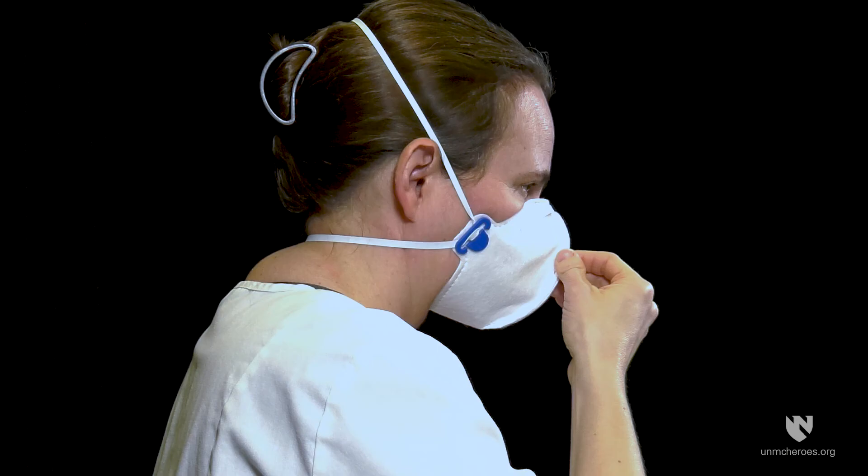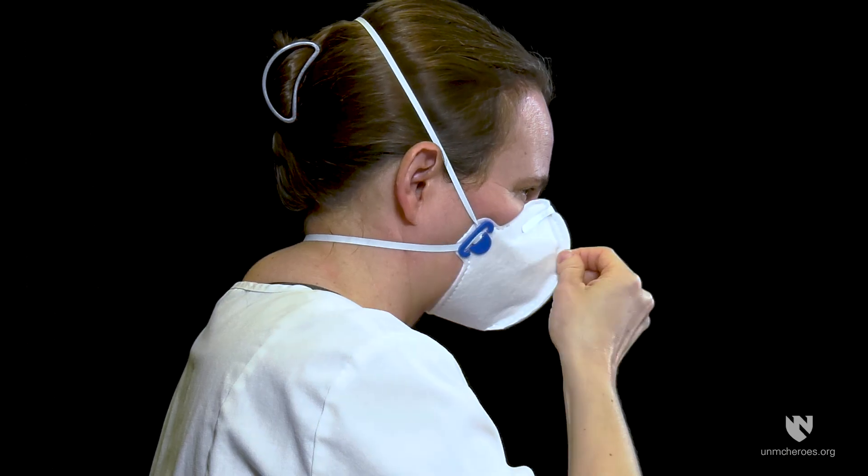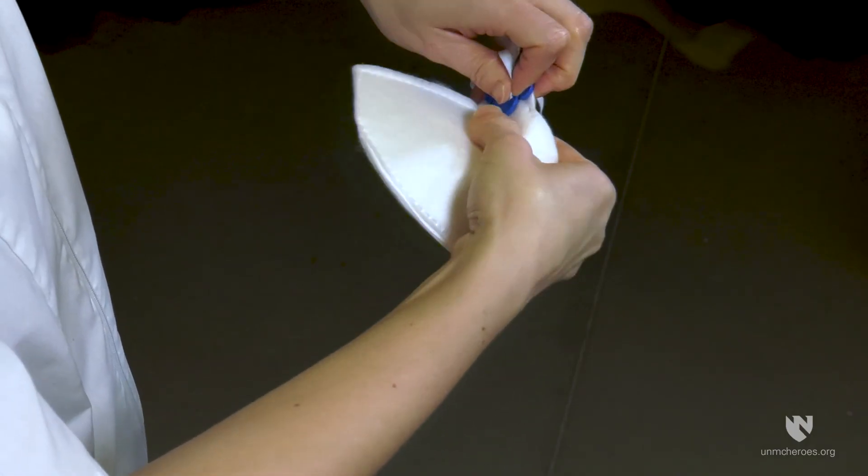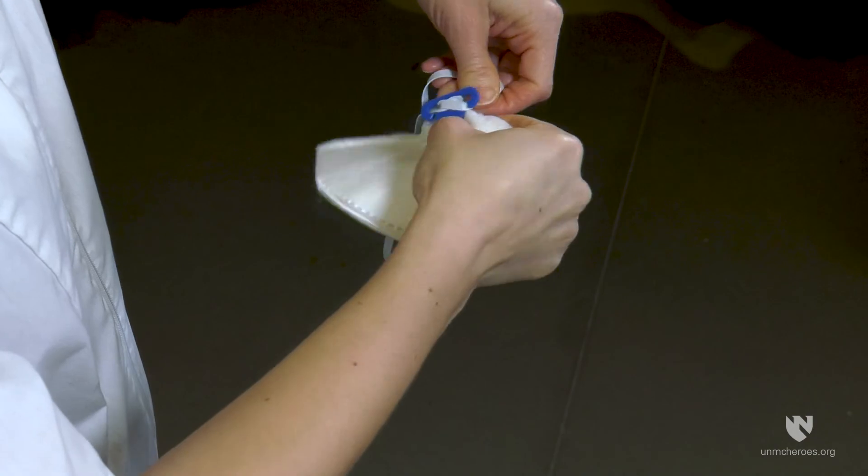Using your finger and thumb in the center of the mask, pinch with a firm grip and carefully pull away from your face. If it is easy to do this, then you should increase the tension of the strap as described previously.